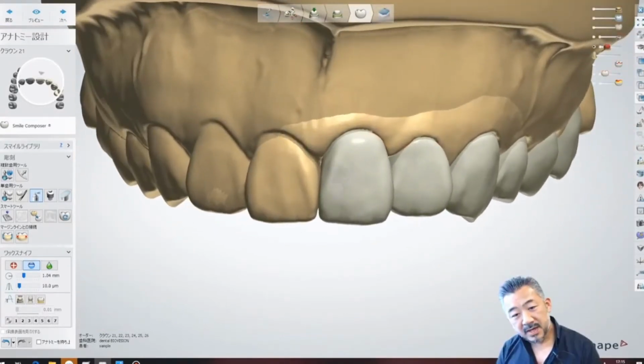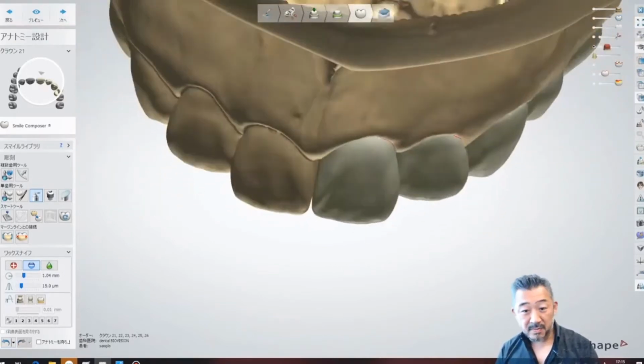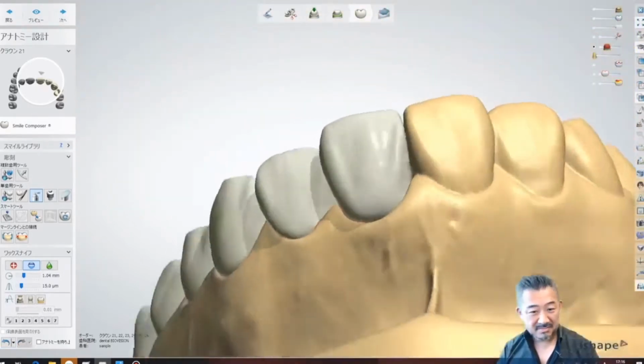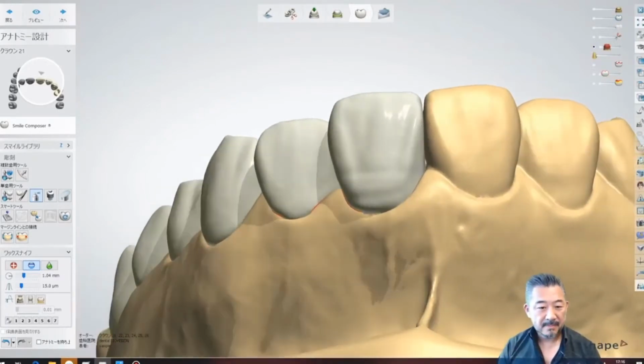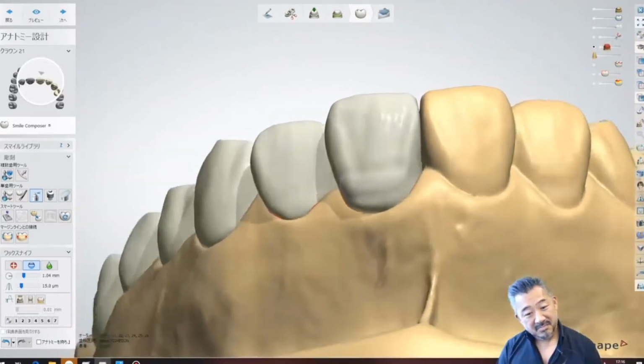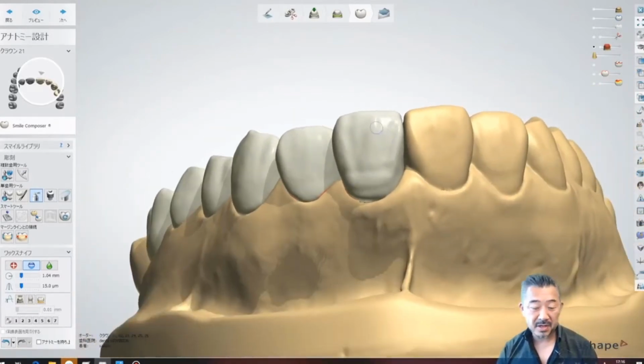I don't know how many of the people who are watching this show right now are using the 3Shape Dental System. I think some people may like exocad. It's no big deal. It doesn't matter which one you choose. In my case, I just like to use the 3Shape Dental System.